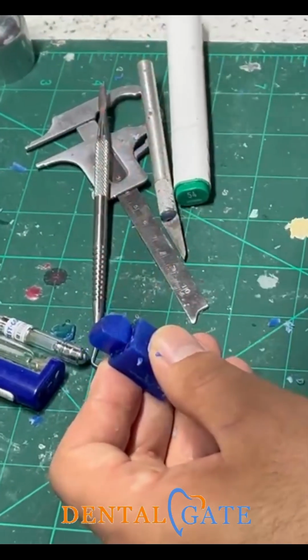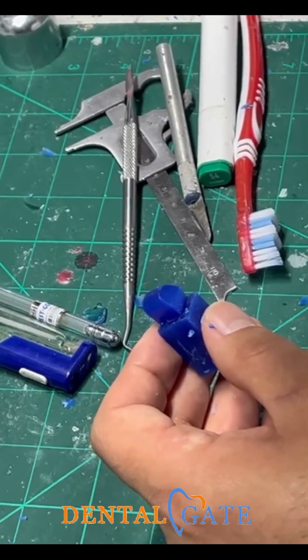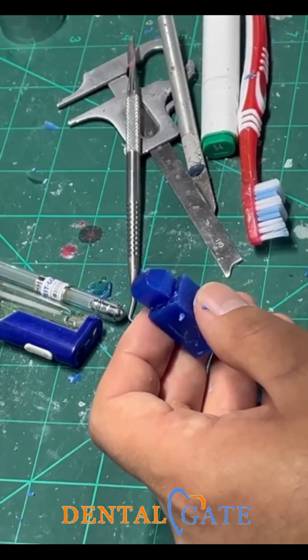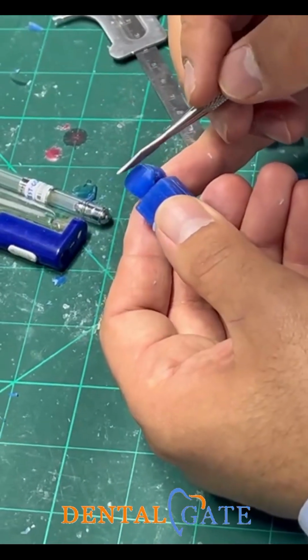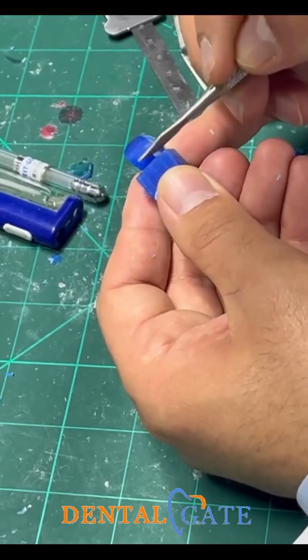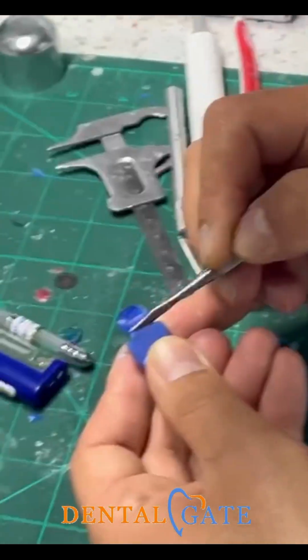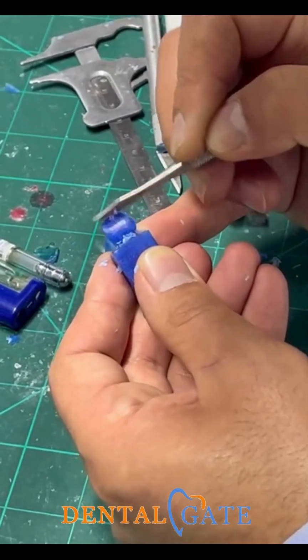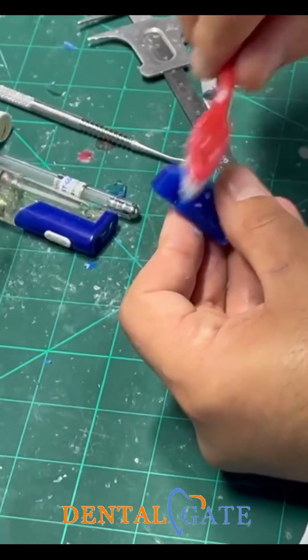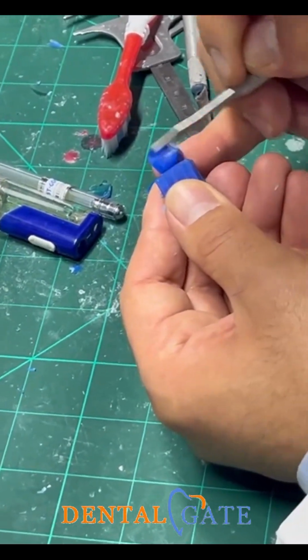Make it in the final stage, after producing all features and outline of the lateral incisor. Make sure the parallelism of the curve is equal in the whole crown. Make sure all aspects will be cut equally.